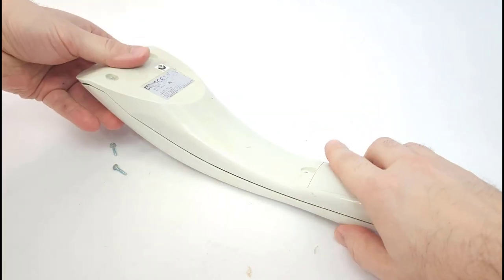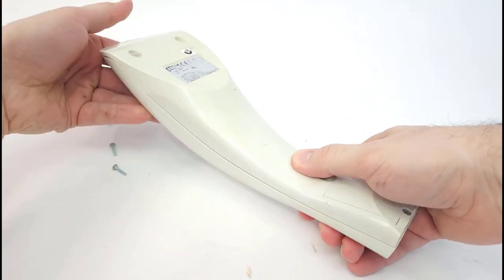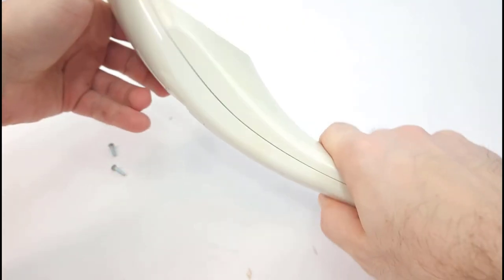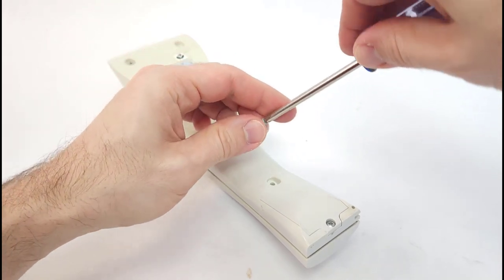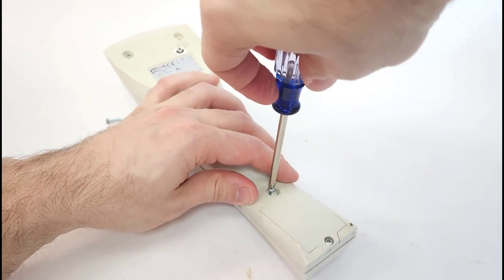And then it's getting mad at me because I'm hitting the buttons on the front. So this can be a little fidgety with getting everything aligned again. You want to make sure that one of the buttons didn't miss and is coming all the way out to the front. Once you get that lined up, you are then going to put on the three final screws that you took off at the beginning, and then you should be good to go.